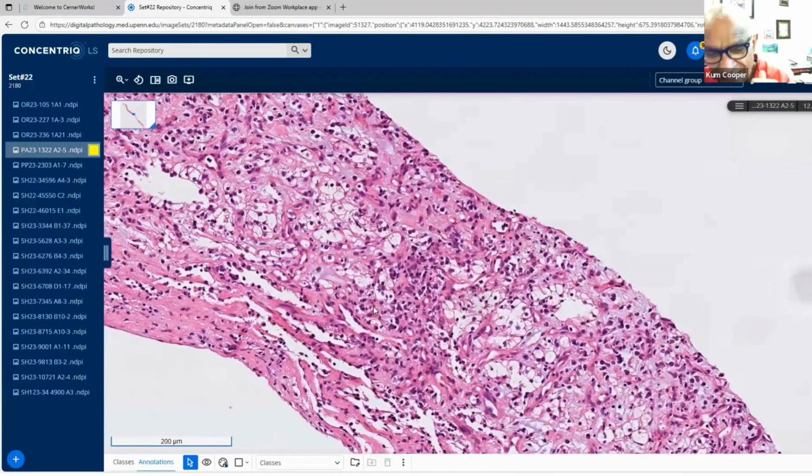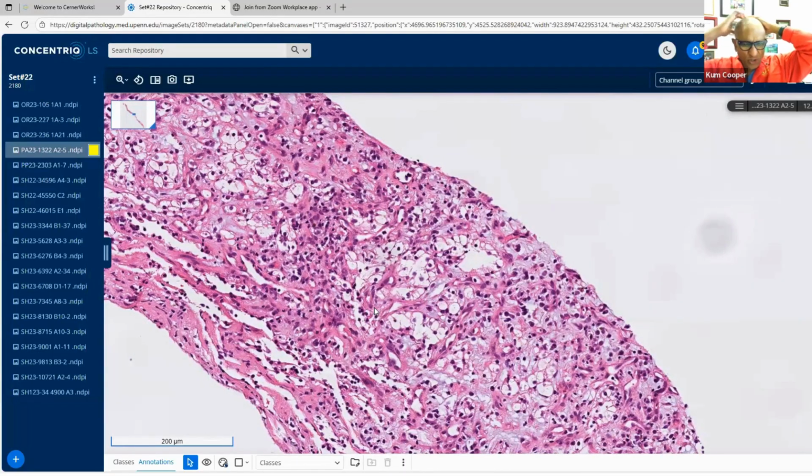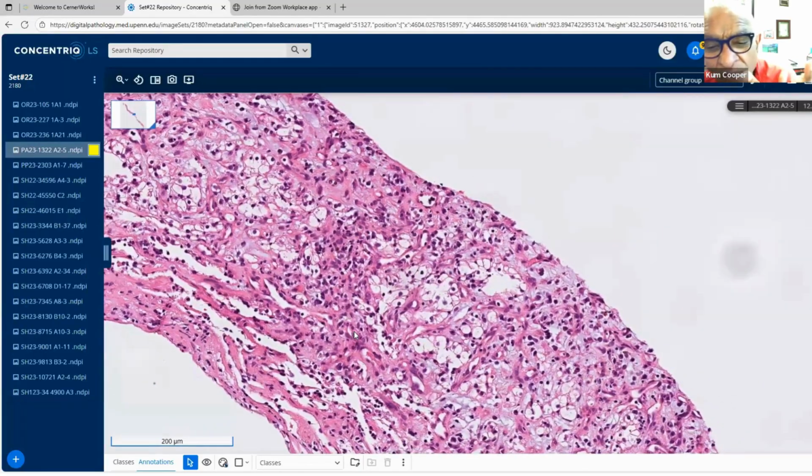I'm sure you'd all have got this, but I needed to approach it with that fibromyxoid pseudotumor approach, so that when you see that in the renal sinus fat, you always have to rule out a carcinoma. In fact, that paper says that up to about 80% of these have carcinomas associated with it, and it can either be renal cell or urothelial. So we got this, like I said, as a referral from the outside, with a mesenchymal differential diagnosis.